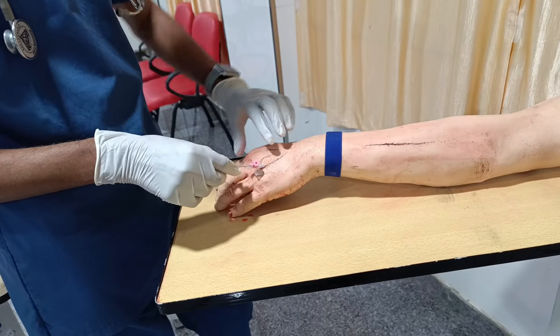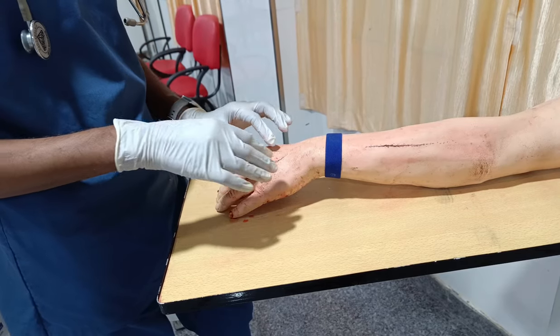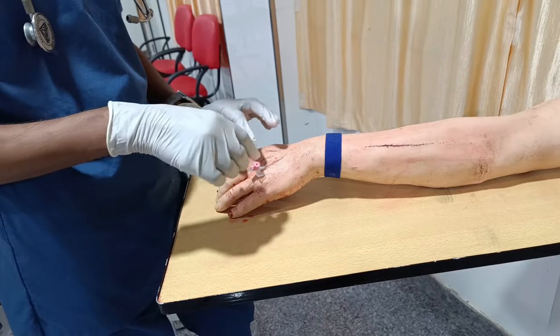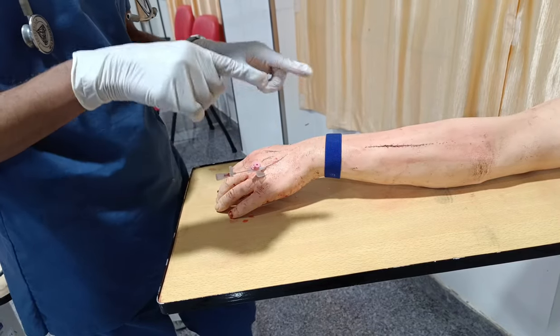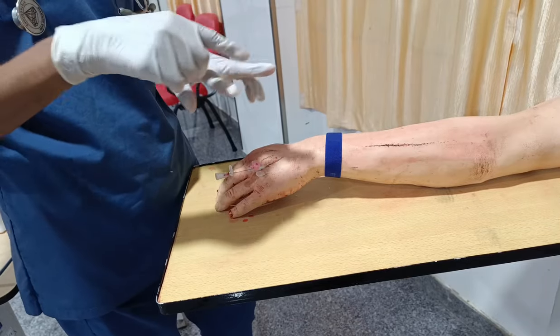So you have to introduce, and then you have to remove the needle. So this portion I am stopping here. Why are we partly withdrawing the catheter, or withdrawing the introducer? If we have already hit the vein, now we are inside the lumen, the intraluminal area.